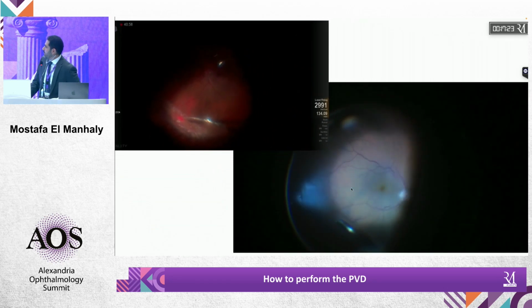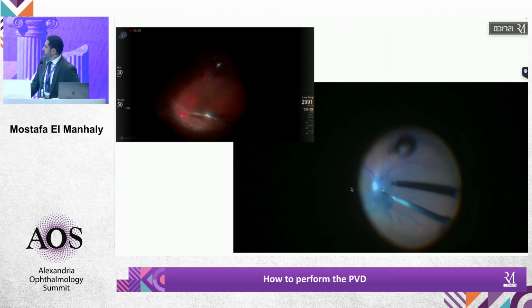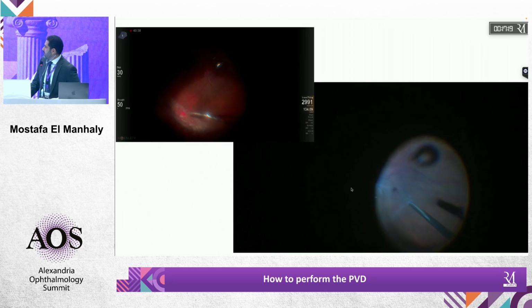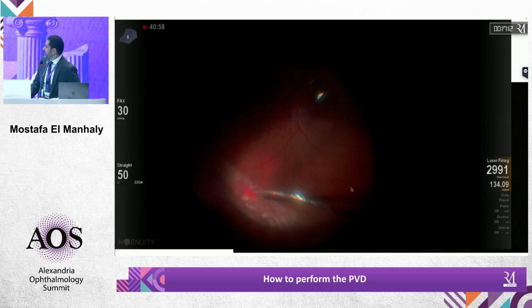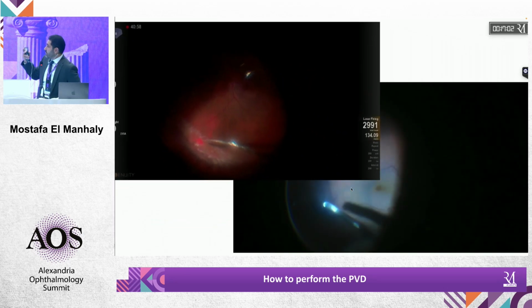Dr. Ehab, please. Definitely, I would remove the tears, and in this patient, I definitely like to do it under indentation because that counteracts the vitreous that's going to jump in the vitreous cutter. Sometimes you enlarge the breaks while trying to do that. So in the periphery, I always counteract by indenting, deep indentation, and shaping it completely, removing whatever tears, the flaps and the vitreous. I never leave vitreous over a flap.